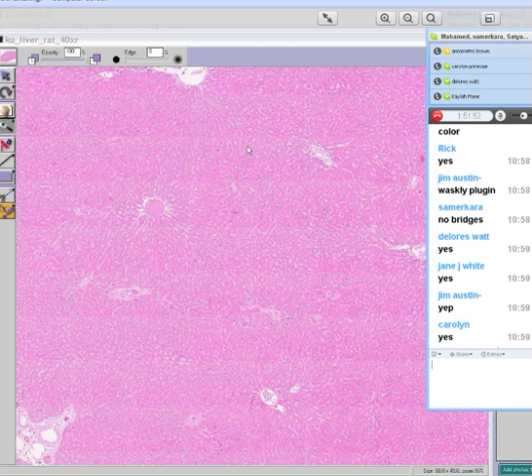When you look at a liver, make sure that you generally have a good, regular interrelationship between central veins and portal veins. Write that down.